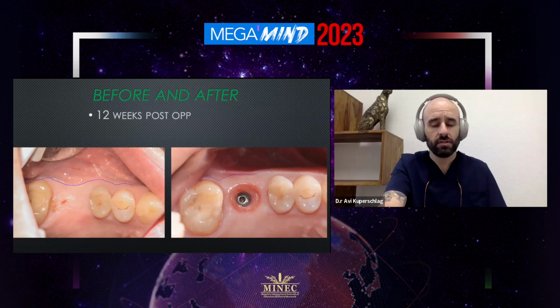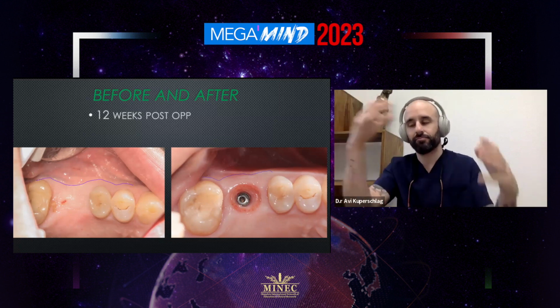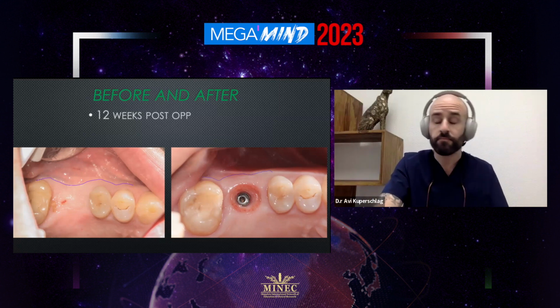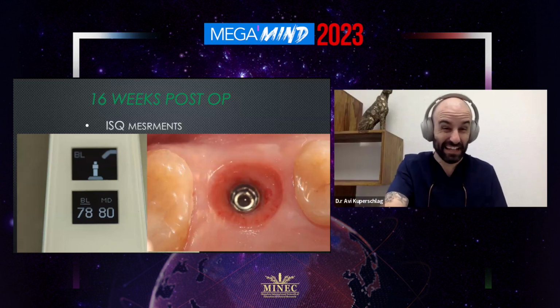I take an impression. The week after, the patient calls in sick. The week after that, I call in sick. Me, him, he cannot, we cannot. We meet again in 1 month, so 4 weeks after, and just to feel safe, we retake the ISQ. And now look at the ISQ. Amazing. This is 70, 78, 80. This is really, really best case scenario.